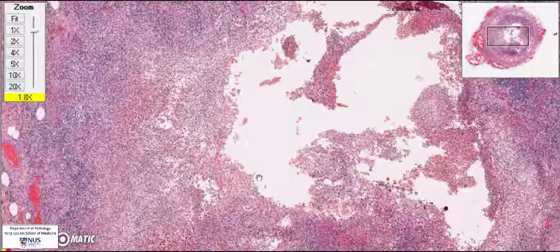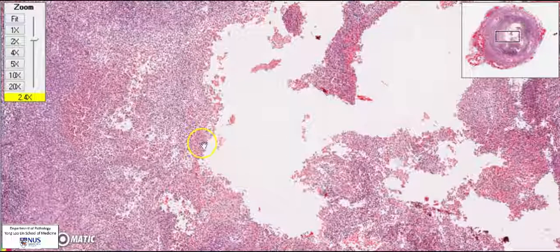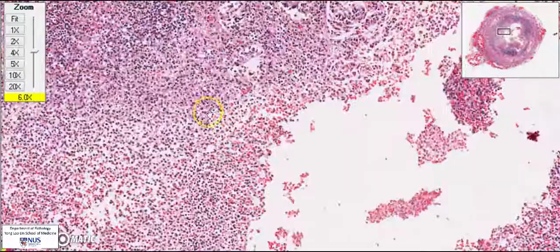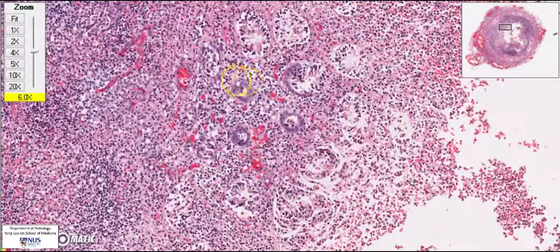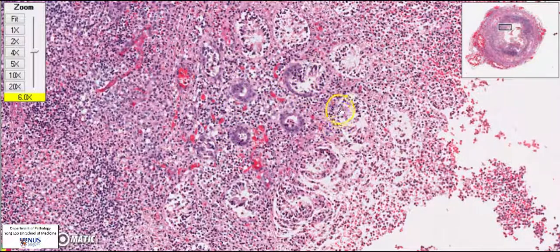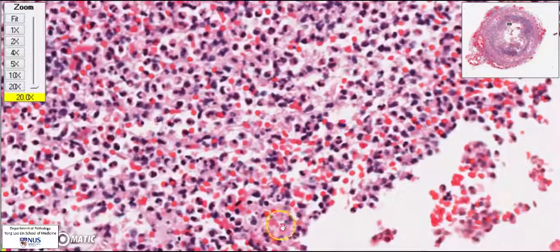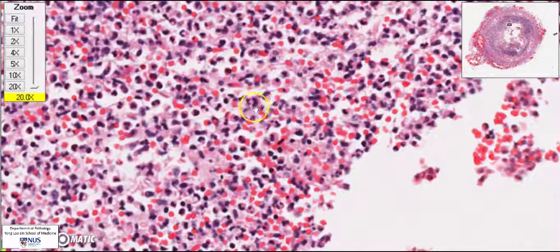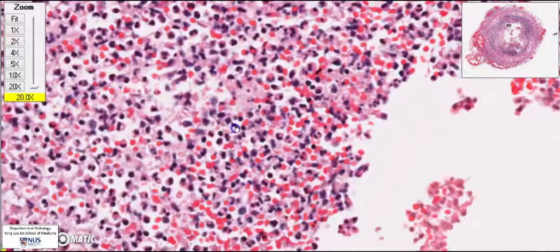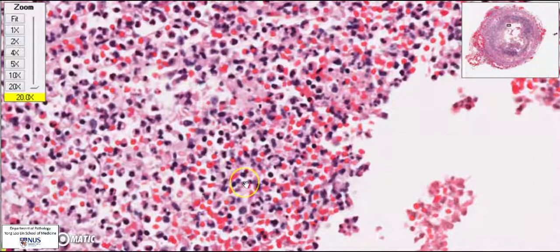Looking at the mucosa, there are hardly any viable glands left. Only very focal, residual crypts can still be made out, and a lot of them are actually dying. Instead, the mucosa has been replaced by loads of neutrophils — these are acute inflammatory cells. Often the nuclei have multiple lobes; these are leukocytes or white blood cells, and all these squiggly nuclei are neutrophils.